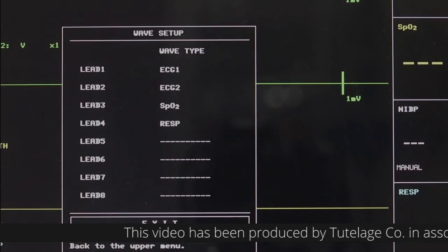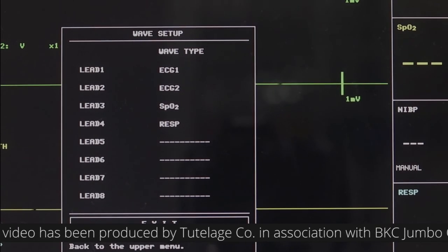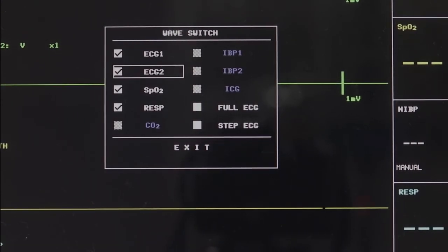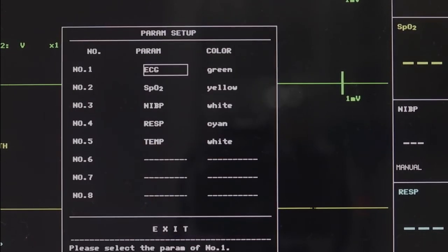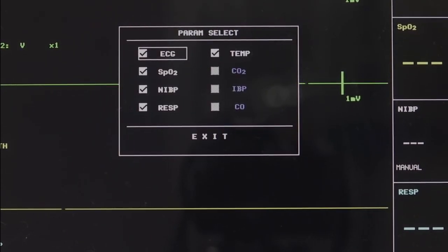Wave Setup shows 8 leads. The waveform position can be changed. Wave Select lets you select the waveforms displayed. Parameter Setup lets you change the position of the parameters and display them in different colors. Parameter Select lets you choose the parameters to be monitored. This can avoid the interference from the parameters that do not need attention.